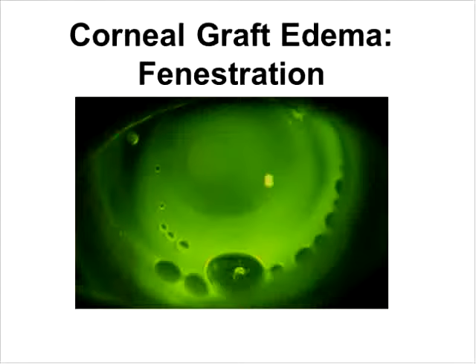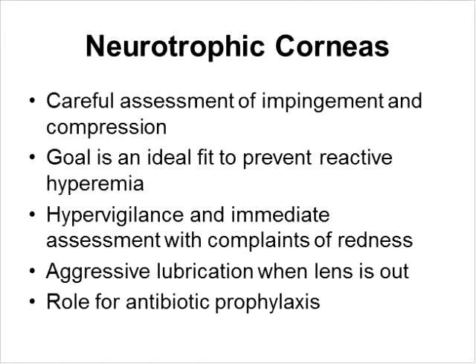This is a case of a gentleman who had a 20/20 graft, but he had a significant ectasia of the graft, and no surgeon wanted to operate on a patient that had a 20/20 graft with a lens. The problem was after 2 to 3 hours of a non-fenestrated lens, he developed microcystic edema. With a fenestrated lens, he did not develop any microcystic edema, and he achieved 15 hours of wearing time. So fenestration can be a powerful tool.